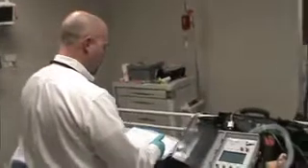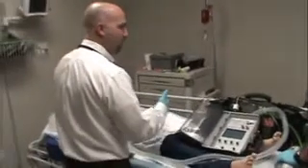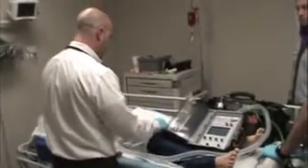So let's see. We talked about high PEEP causing problems for the patient's hemodynamics. We can make sure that they'll crash their blood pressure if they have too much PEEP. We also set them up for lung injury if their PEEP is too high, and we also set them up for pneumothorax if they can't regulate that pressure in their chest on their own.